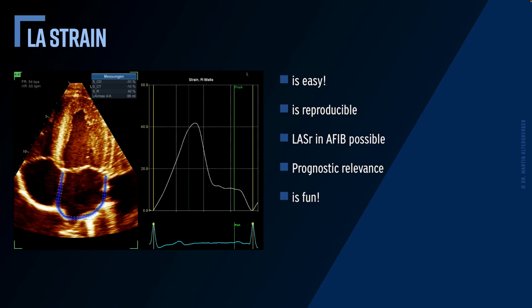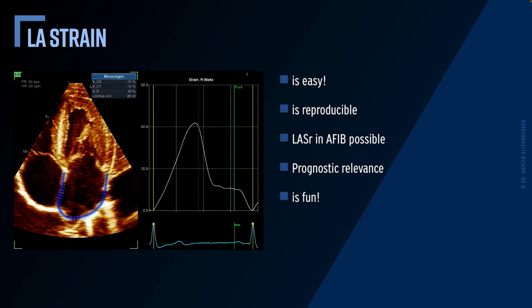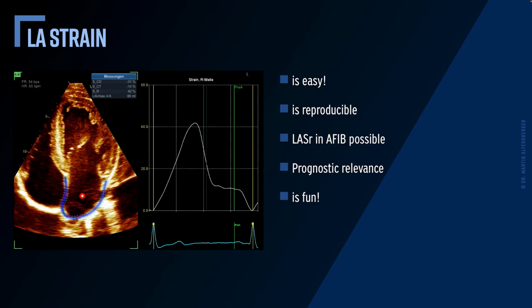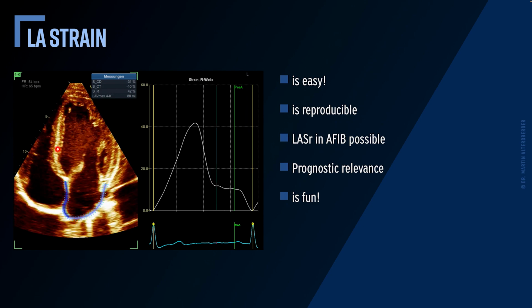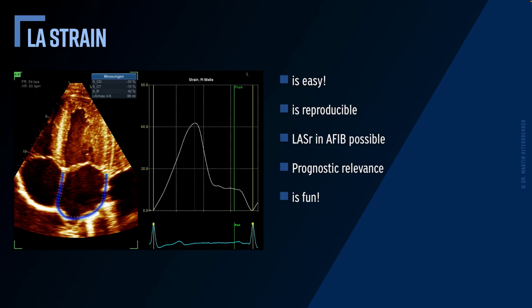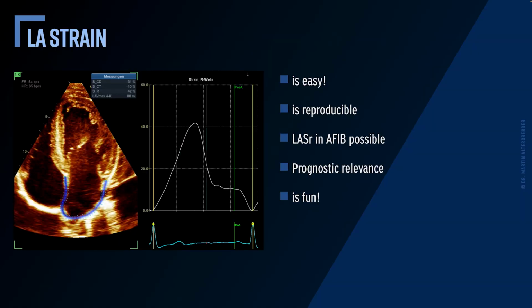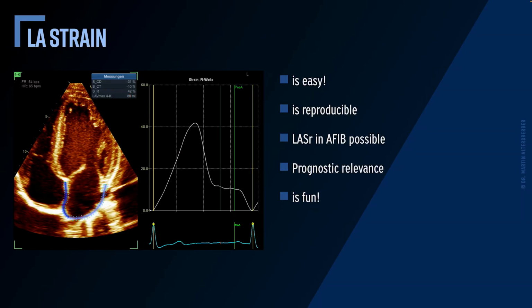He is an athlete, but he also did and does steroids. So we have a significant dilatation of the ventricle and also the atria, the right ventricle as well. We also have significant thickening of the left ventricle. But even though he is in a situation where the heart doesn't look morphologically normal anymore, the measurements are still in a normal range. We have a reservoir strain of 42%.